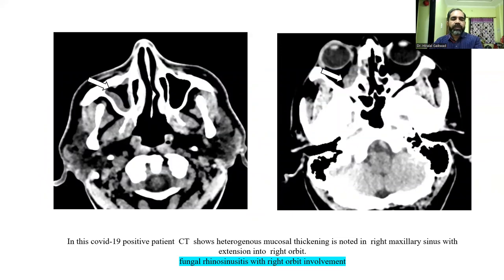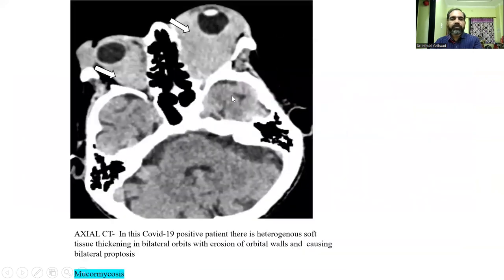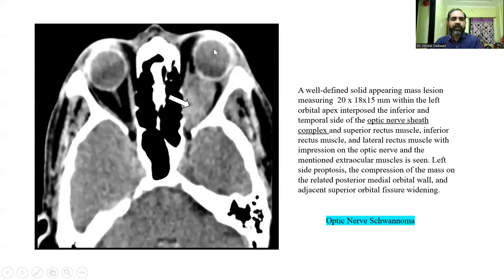In this COVID-19 positive patient, the CT image shows heterogeneous mucosal thickening in the right maxillary sinus. This is also a COVID-19 positive patient. In this image, heterogeneous soft tissue thickening in bilateral orbits with erosion of orbital walls causing bilateral proptosis was seen. This was also a case of mucormycosis.